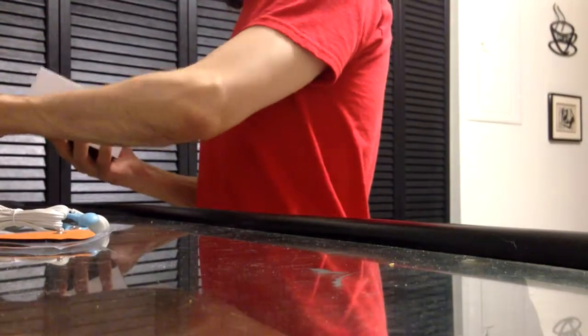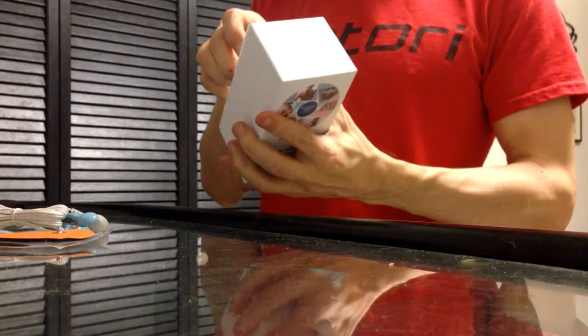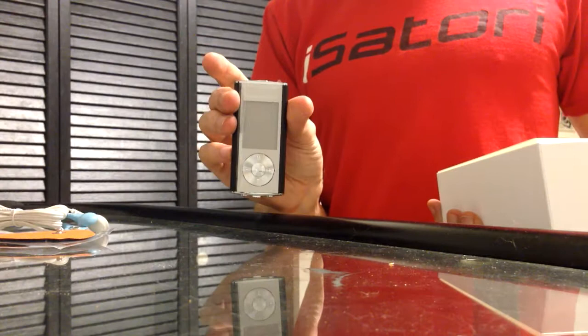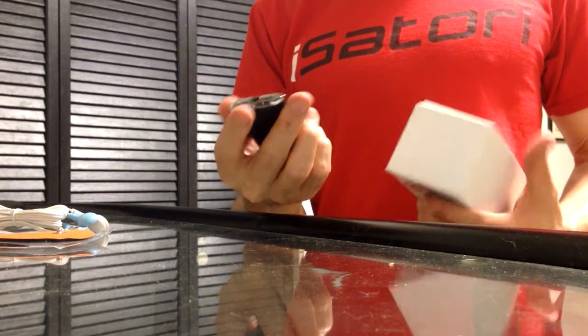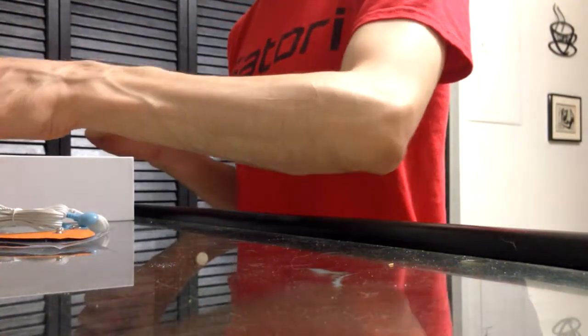Whoa man, oh my god — it's tiny! It looks like a freaking iPod, very small. It plugs into your computer to charge. I didn't want to get the ones that use batteries because they eat up batteries quickly.